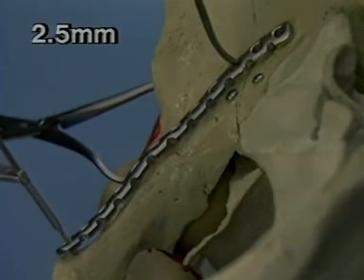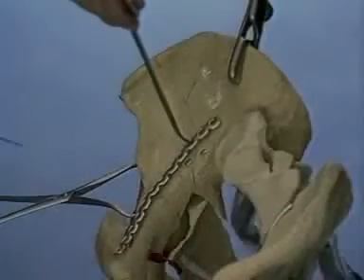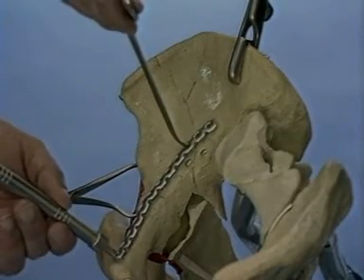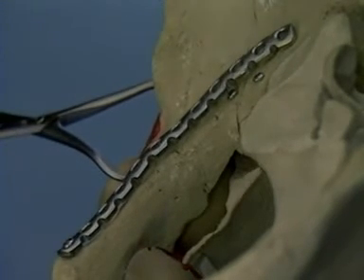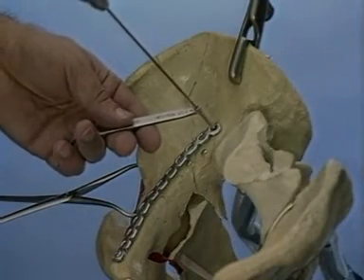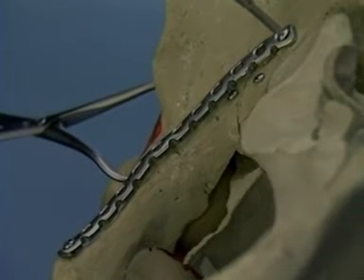A 2.5 millimeter hole is drilled through the distal plate hole for insertion of the 3.5 millimeter screw. The depth is measured and the screw is inserted, but not fully tightened. When the surgeon is satisfied with the final plate position, a 2.5 millimeter hole is drilled through the proximal plate hole. The depth is measured, a 3.5 millimeter screw is inserted and tightened along with the distal screw.